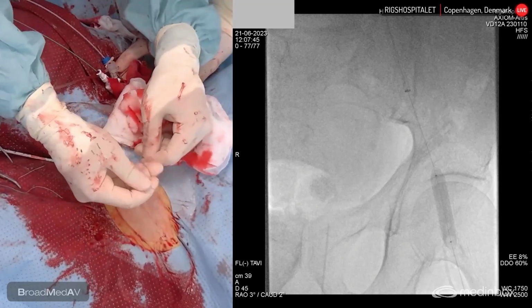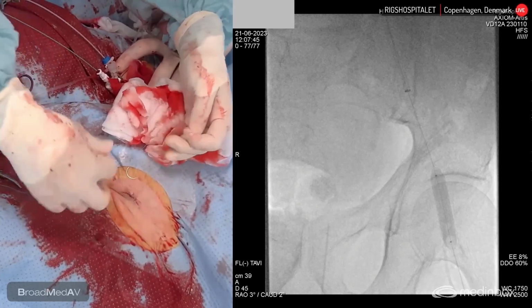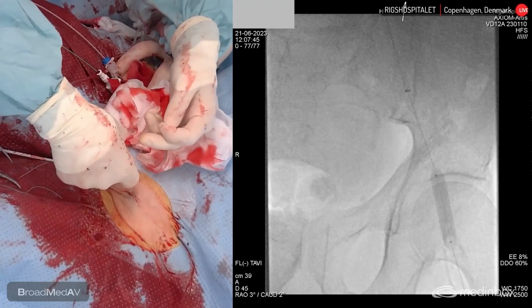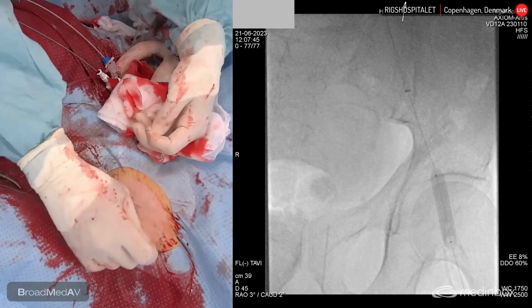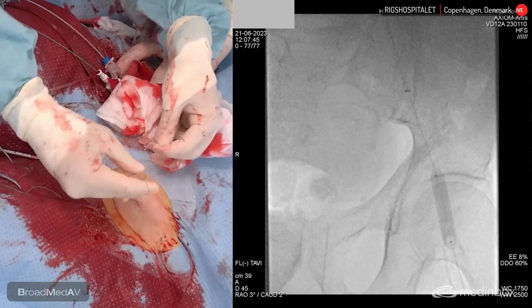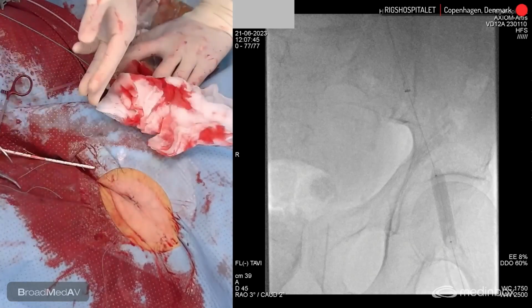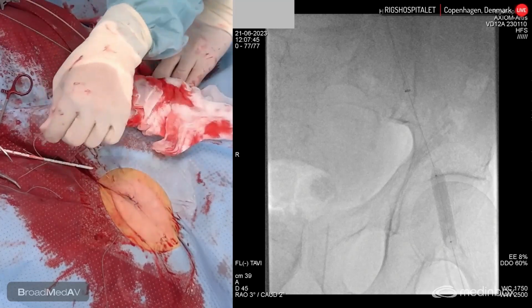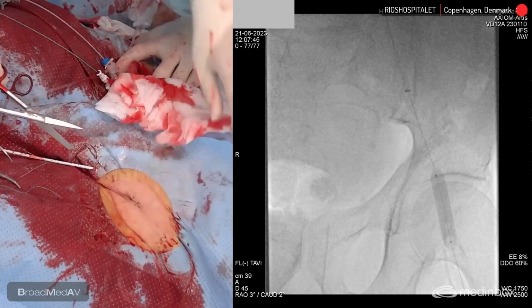So I think we're almost ready for you. We'll show you still the end. We still have time, so we can still be in 10 minutes. We'll be finished completely. You can see until the end because I know we have a 2-hour time slot. So, yeah, crossing. How to cross an Acurate. You have to overlap. What we did is you have to overlap 2 posts.